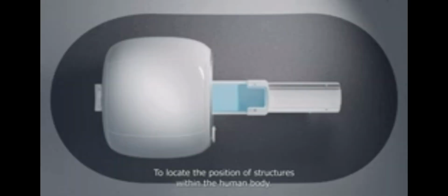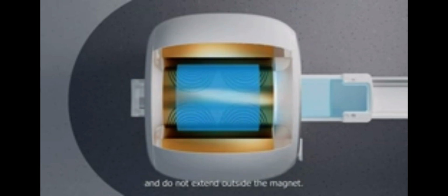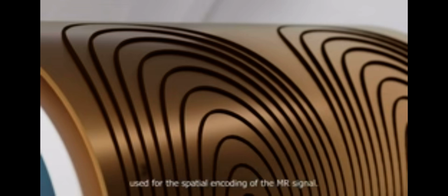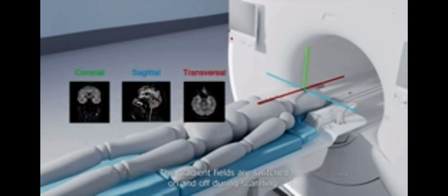To locate the position of structures within the human body, each MR system applies switched gradient magnetic fields. These switching gradient fields are only active during scanning and do not extend outside the magnet. Every MRI system includes a set of 3 gradient coils. These gradient coils create the gradient magnetic fields used for the spatial encoding of the MR signal. The gradient fields are applied in 3 orthogonal directions to create different imaging planes. The gradient fields are switched on and off during scanning.